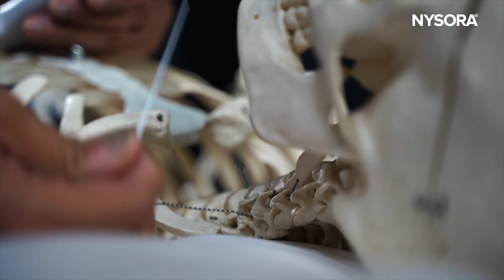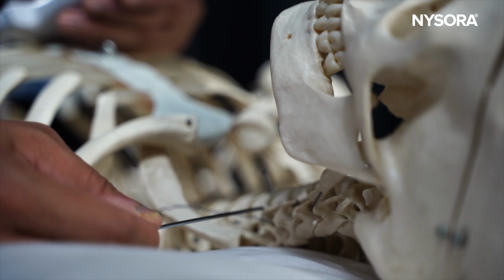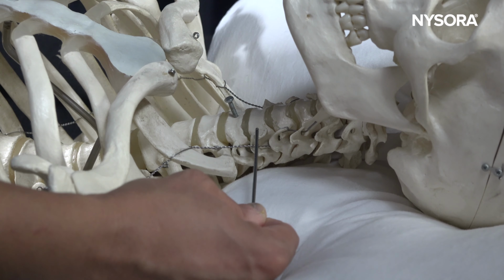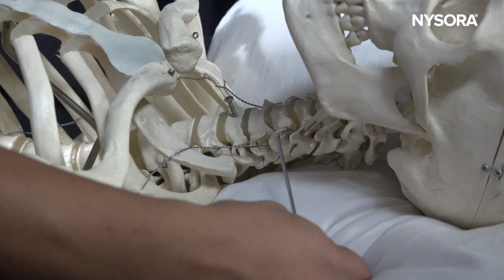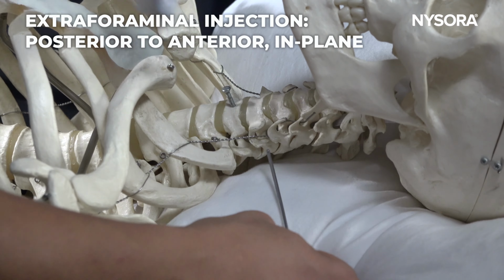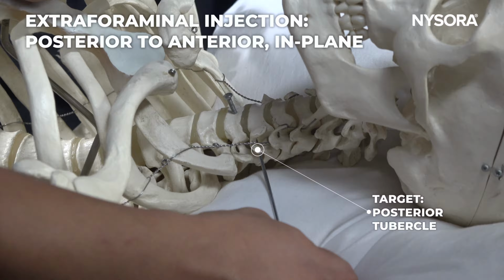When you talk about the extraforaminal injection, when we use ultrasound, we never go transforaminal because you're not going into the foramen. You're looking at the bony silhouette of anterior tubercle, posterior tubercle, and you bring the needle from posterior to anterior in plane, and you will stop at the posterior tubercle, and you will then inject dye.